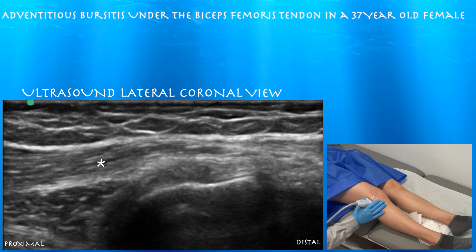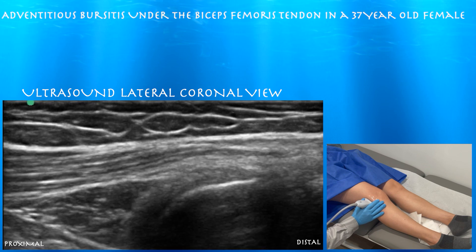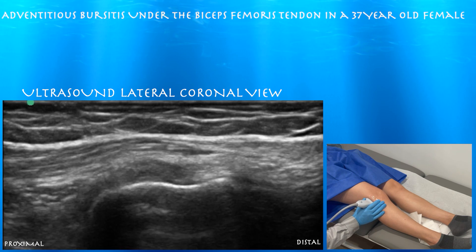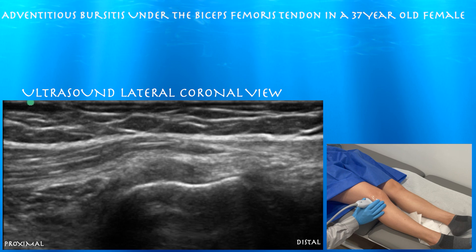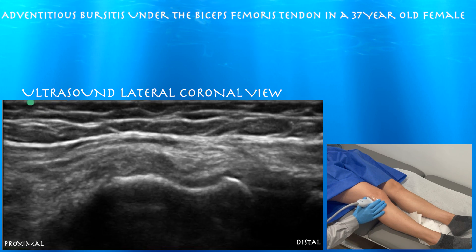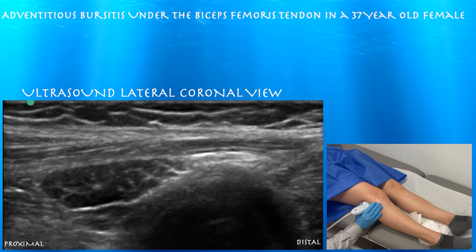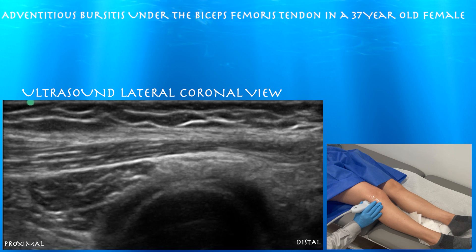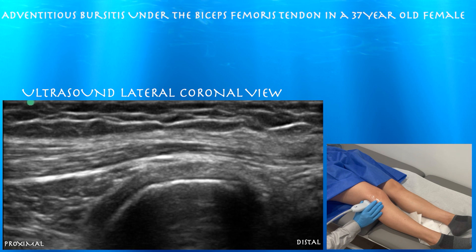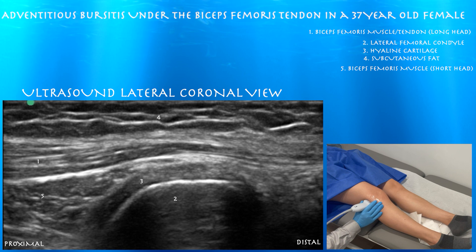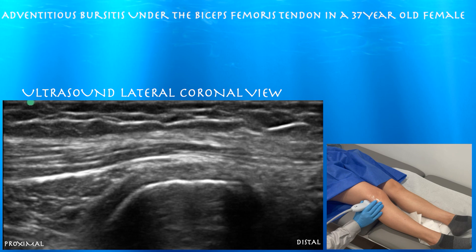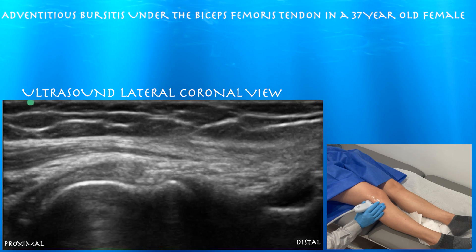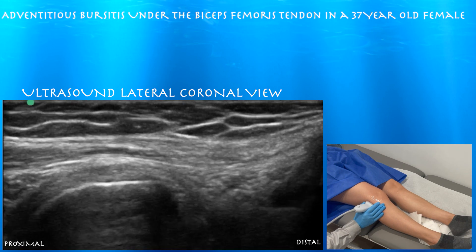Here again you can appreciate the long and short head of the biceps femoris musculature blending into a tendon. We can also appreciate some of the hyaline cartilage over the lateral femoral condyle posteriorly — looks like a pretty healthy layer of cartilage. You can also appreciate the layering of the muscles and the short head of the biceps femoris, which is deep and broad and feeds into the biceps femoris tendon along with the long head.